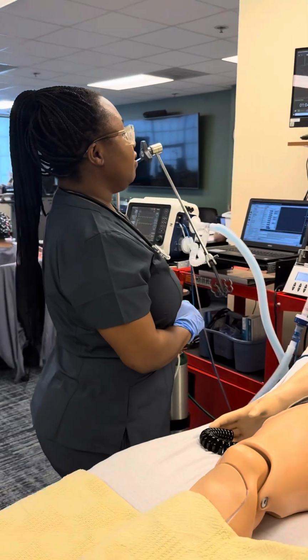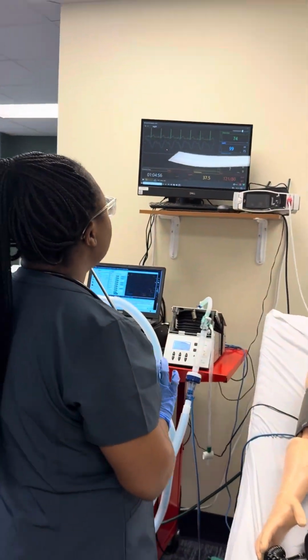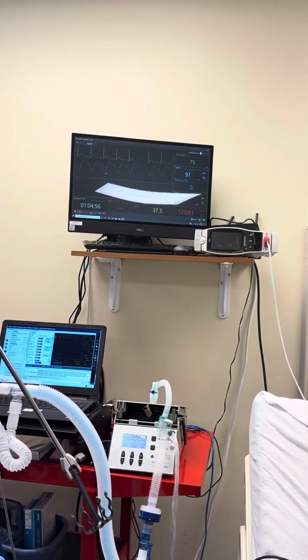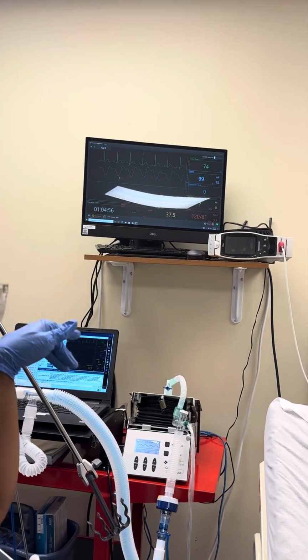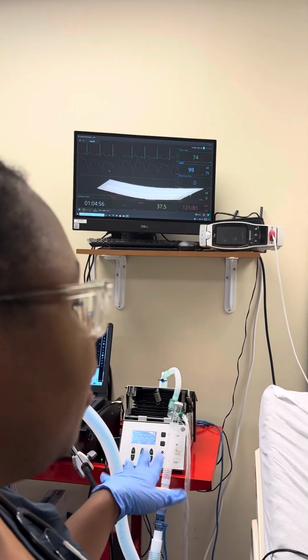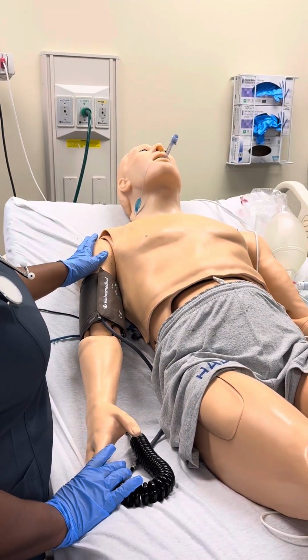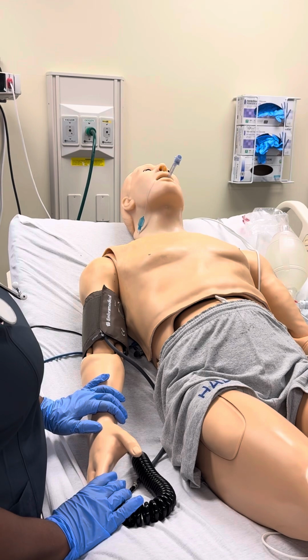Patient's heart rate is 75. Oxygen is 99. Blood pressure is 120 over 81. Temperature 37.5. Patient looks pink, so color is fine. We have chest rise.